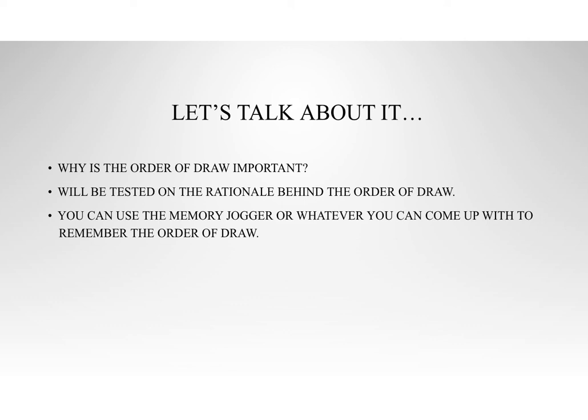The order of draw is so important because you're going to be tested on the rationale behind it. You're going to need to know, why do I need to draw these tubes in this order? Because it can greatly affect patient test results, okay? And then you can also use a memory jogger, some kind of saying or phrase, whatever you can come up with to remember the order of draw, okay?